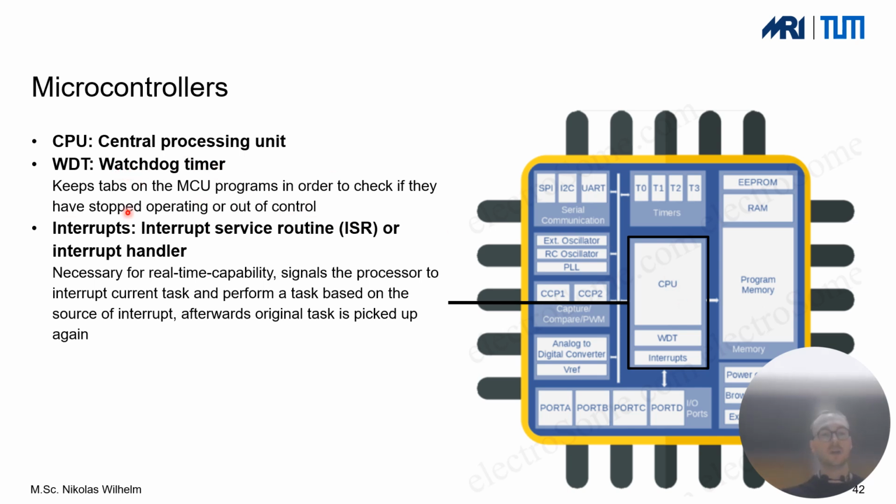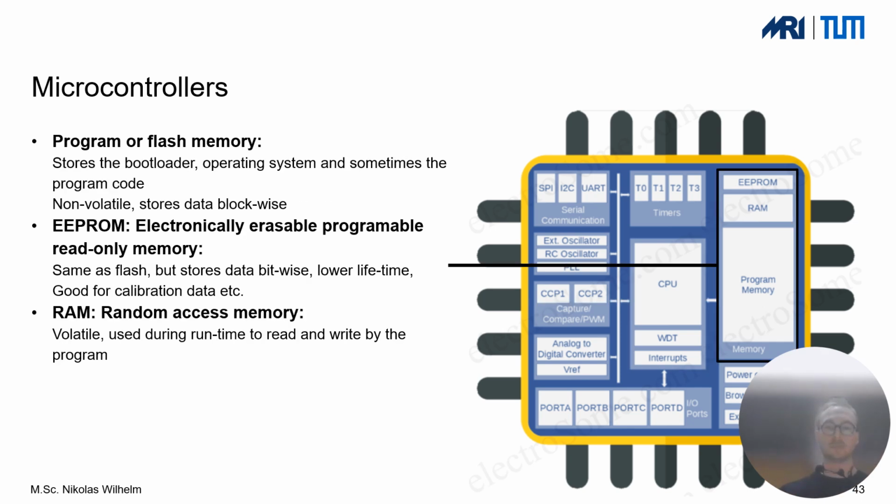They check which kind of processes the CPU should perform right now. And one thing also quite important, we have some interrupts here in this central part that allow us, if there's something safety critical, which might also be important for medical devices, to directly interrupt everything we're doing right now, every calculation we're doing, and directly handle that immediate threat and prioritize that part first.